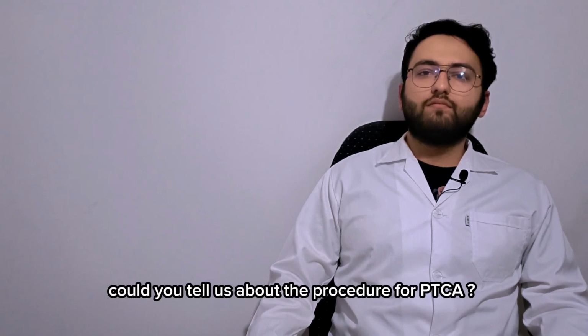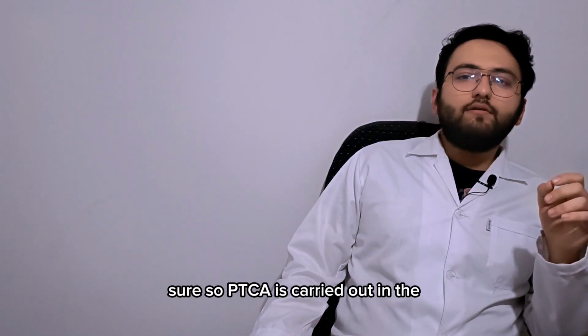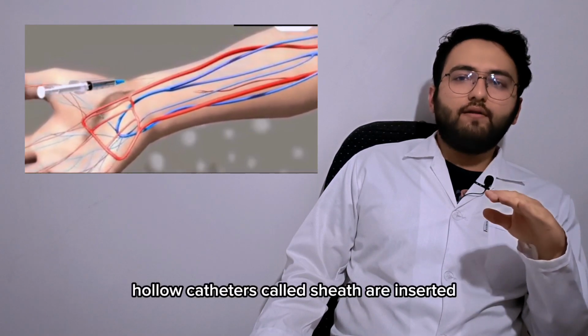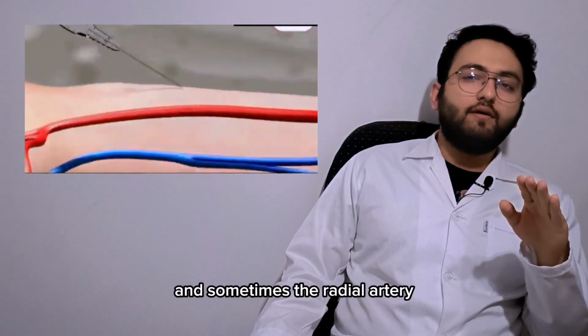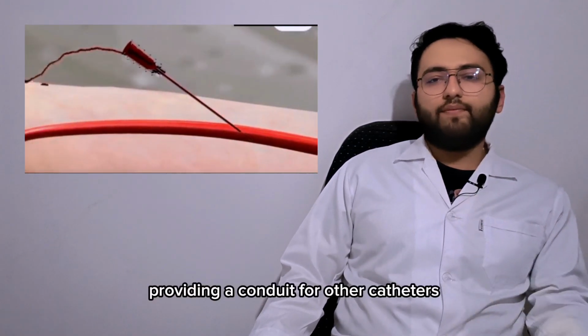Could you tell us about the procedure for PTCA? Sure. So PTCA is carried out in the cardiac catheterization laboratory. Just as CAG, hollow catheters called sheaths are inserted, usually in the femoral artery and sometimes the radial artery, providing a conduit for other catheters.